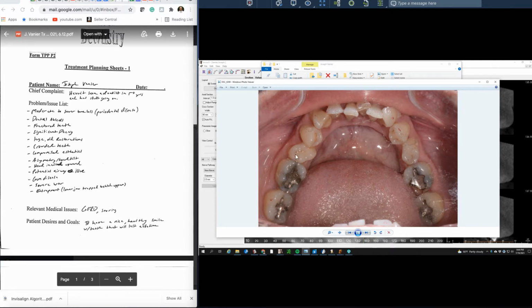That's an interesting premolar. So large old restorations, we always want to let patients know that restorations of this kind are likely to cause a problem that requires the removal of a tooth, whereas if we restore it, we remove that from being a likely possibility. But these are terms you already know.